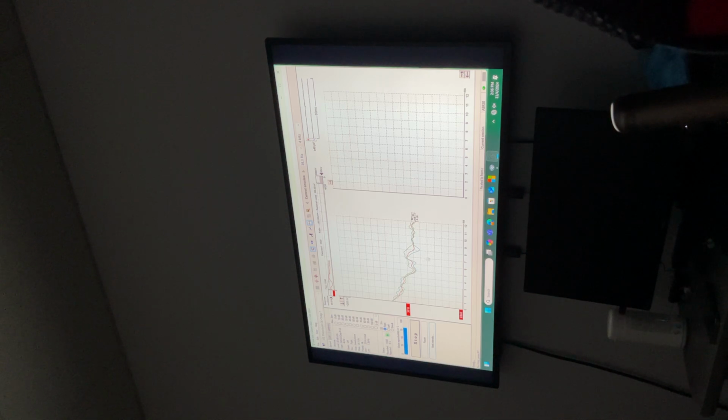So this is, sorry, this is too early. What's going on? So this is wave 5. So you need to be really careful with the latency. Before you mark the peak, you should always look at the latency. So I was thinking this is wave 5. It's too early, it's 3 or 4 milliseconds. I didn't realize, yeah.